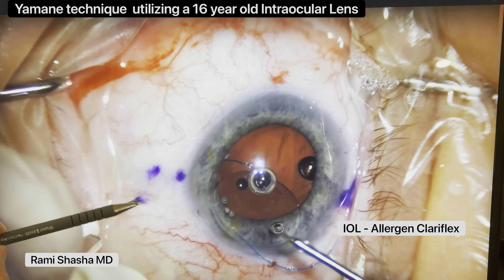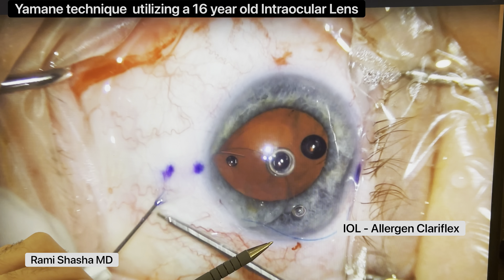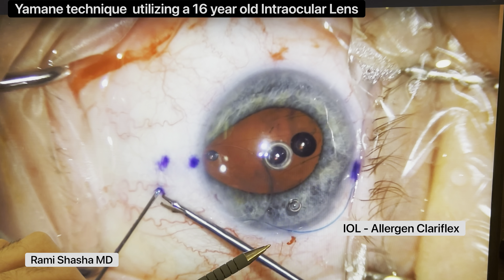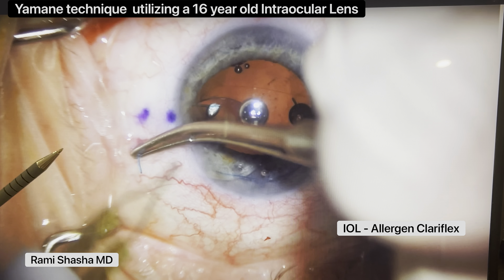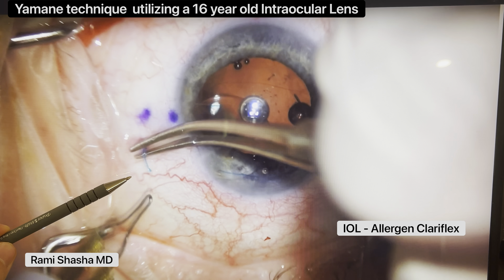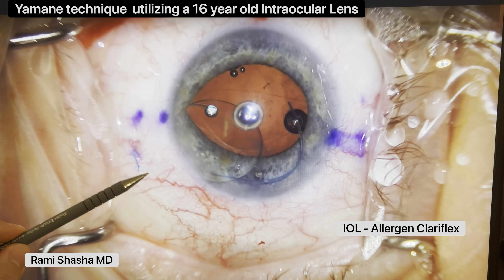I'm going to externalize now. Just be careful — as you're externalizing, the optic will also move, so you want to be very mindful of that. Here comes the haptic. I'm going to cauterize the tip here, and you're going to see that little flange. And then I'm going to do the same thing on the other side.